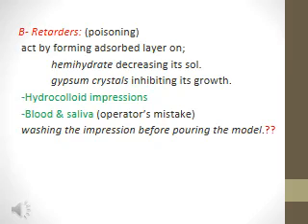Number two, blood and saliva. Before transferring to this point, when you take an impression with hydrocolloid impression, before pouring it with a gypsum product, you have to immerse it.